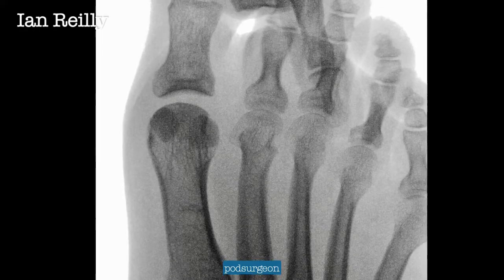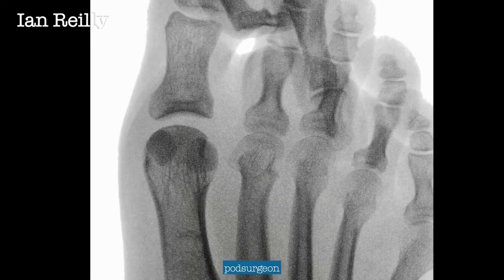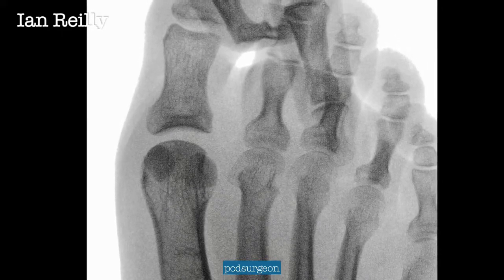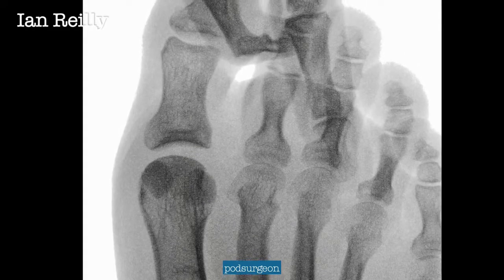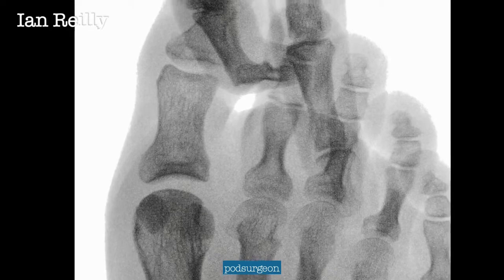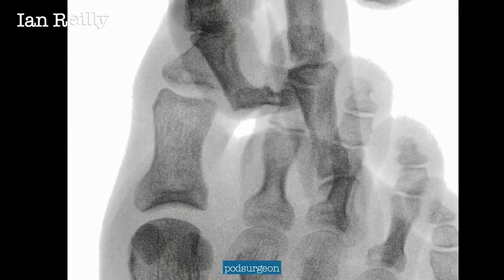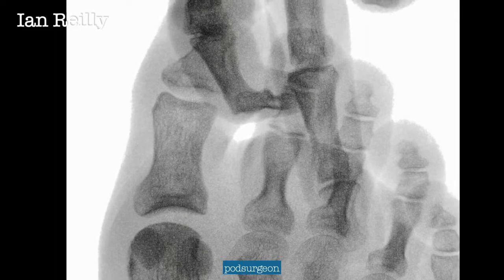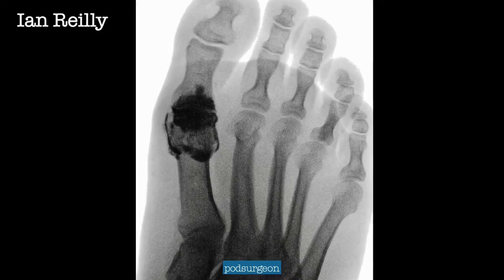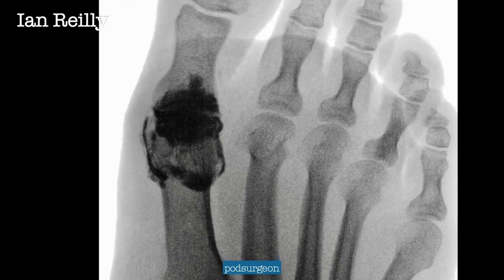Another technique tip is to show you how much distraction you can get on the toe. If you pull it out distally and try not to get your fingers in the X-ray beam, it really opens up that joint space. If you distract and plantar flex the toe, it makes it much easier to get the needle in there. After you've injected the radio-opaque dye, you can check the X-ray again, make sure you are actually in the joint, and then you can inject your steroid.